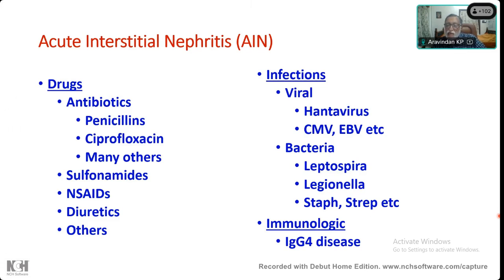But the unexplained ones are the ones in which you do biopsies, and we end up with more cases of drug-induced, and sometimes, rarely, IgG4 disease or other things. So what is the indicator that this could possibly be drug-induced in our case? Eosinophils. The presence of eosinophils strongly indicates that there is an offending drug usually producing that, and these are the list of drugs that can produce this.